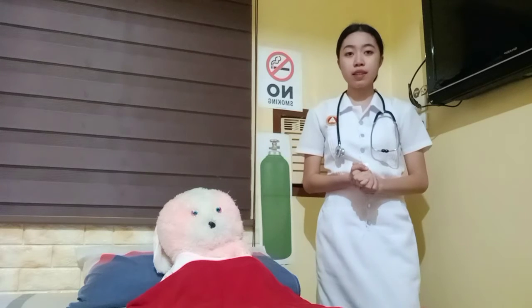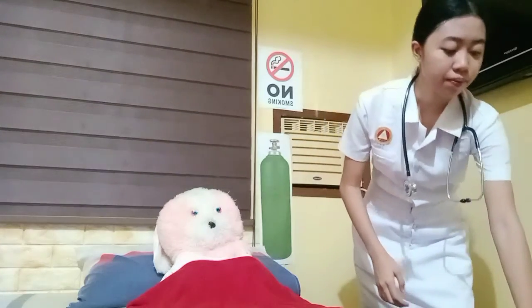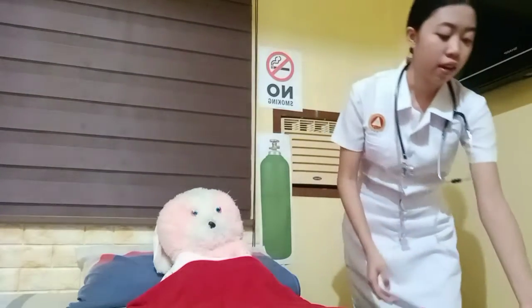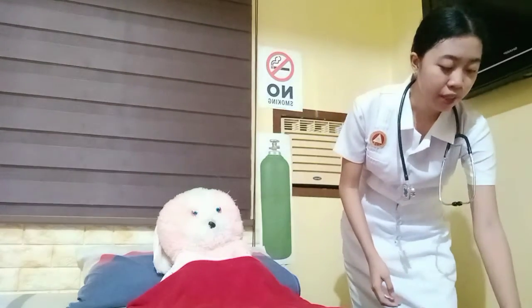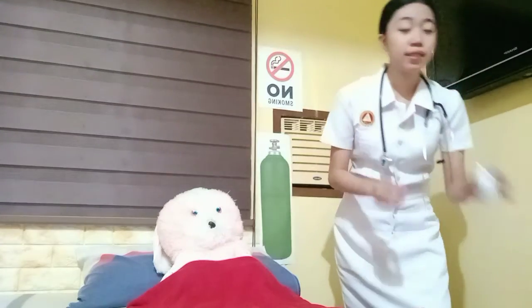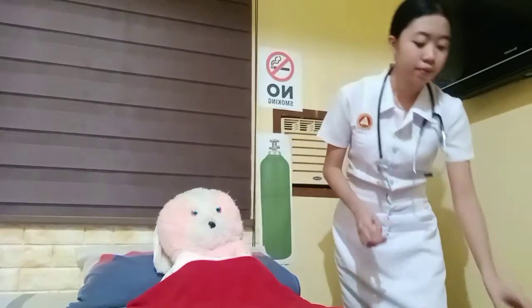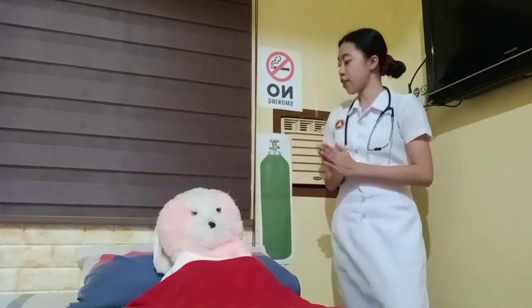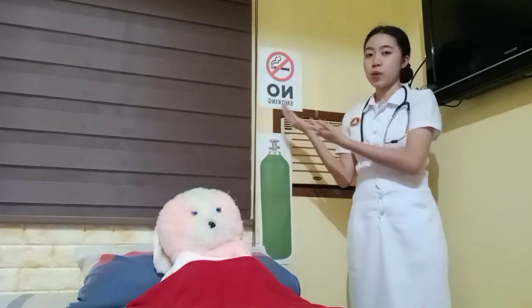So for the planning, assemble and prepare all the equipment needed. This includes the appropriate oxygen delivery system. So I have here a nasal cannula, and then a humidifier, a flow meter, sterile water or distilled water, a tape. I also have here an oxygen source, and as you can see here, the no smoking sign.